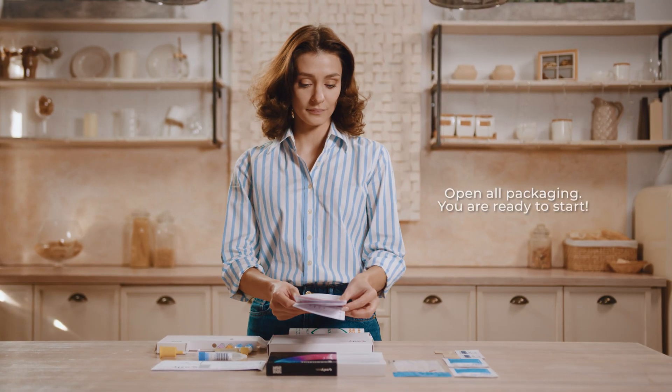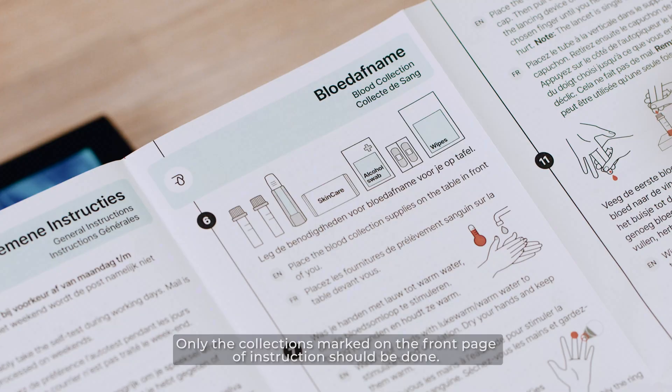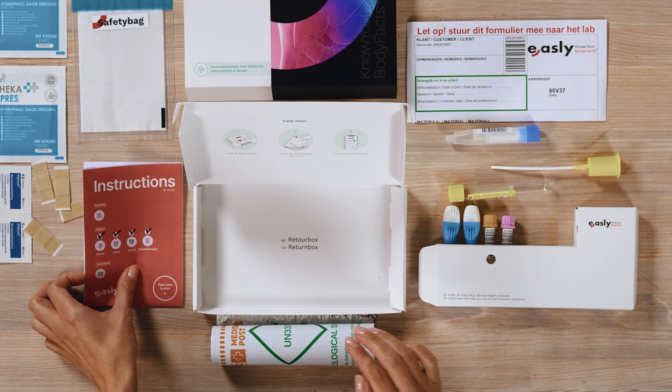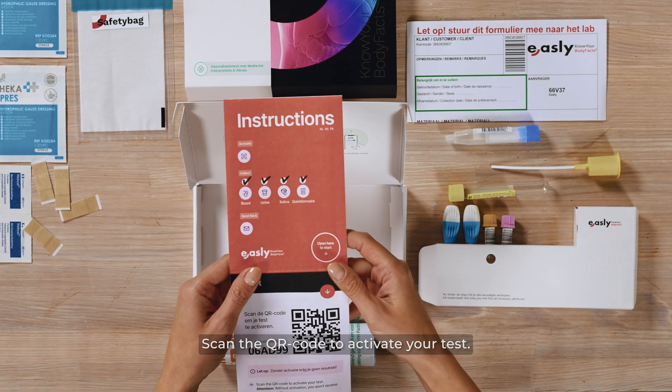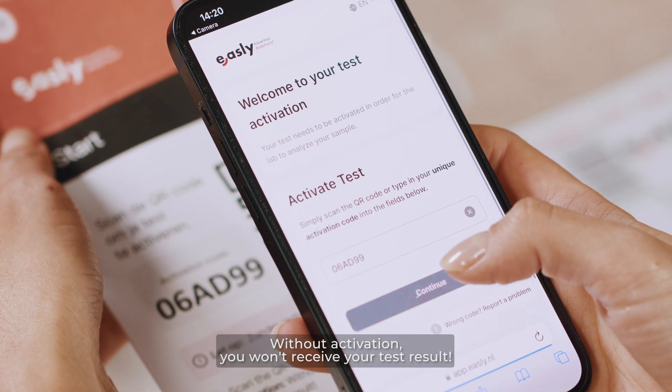Open all packaging — you are ready to start. Only the collections marked on the front page of the instructions should be done. Scan the QR code to activate your test. Without activation, you won't receive your test result.